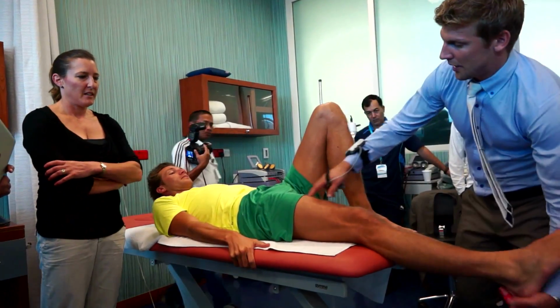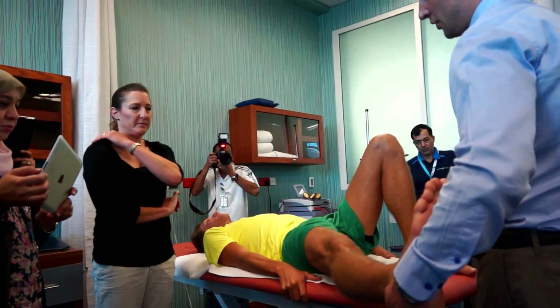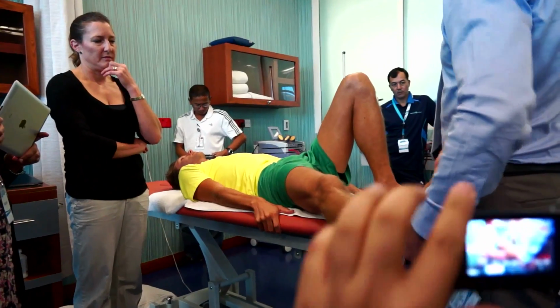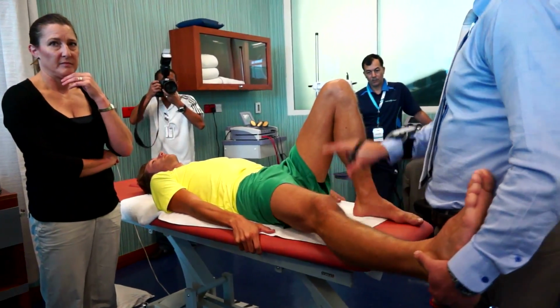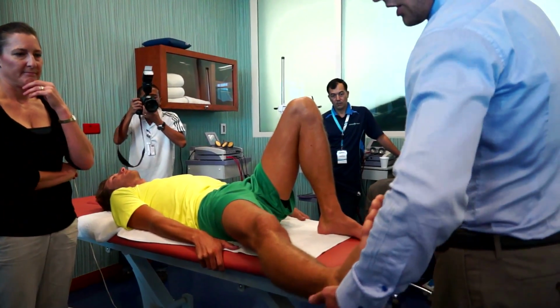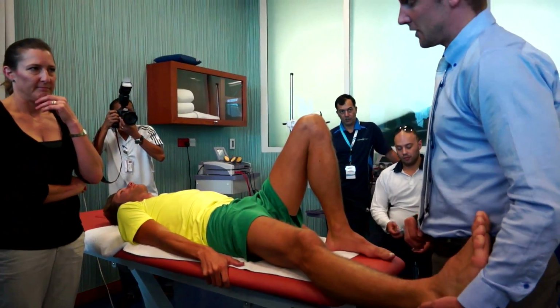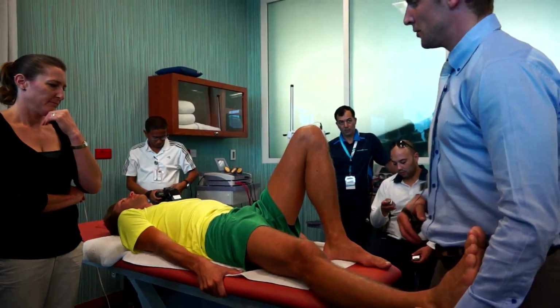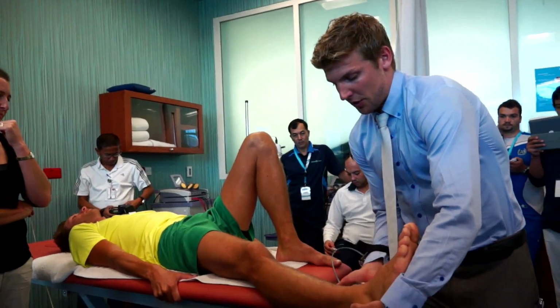So if you hold on to the bed. There you go. We'll get the tested leg out into maximal abduction, and you get the feeling here, and you know about how far out he can go, because that will vary from patient to patient as well. So this is mainly to look for side-to-side differences. So then you take it a little bit in again, so you leave room for the eccentric break. It's important to tell the patient to really contract his abdominals, so he's stable in his pelvic area, and then you use the same measure as you did before.